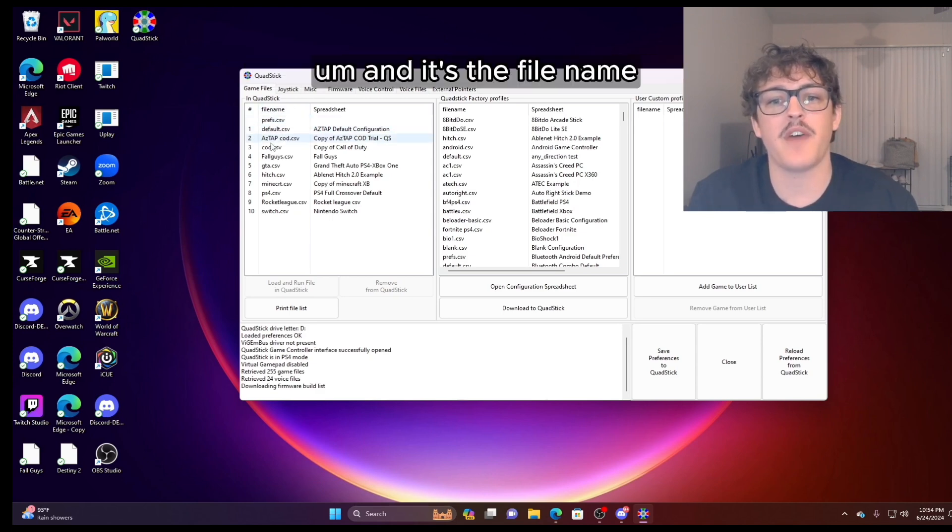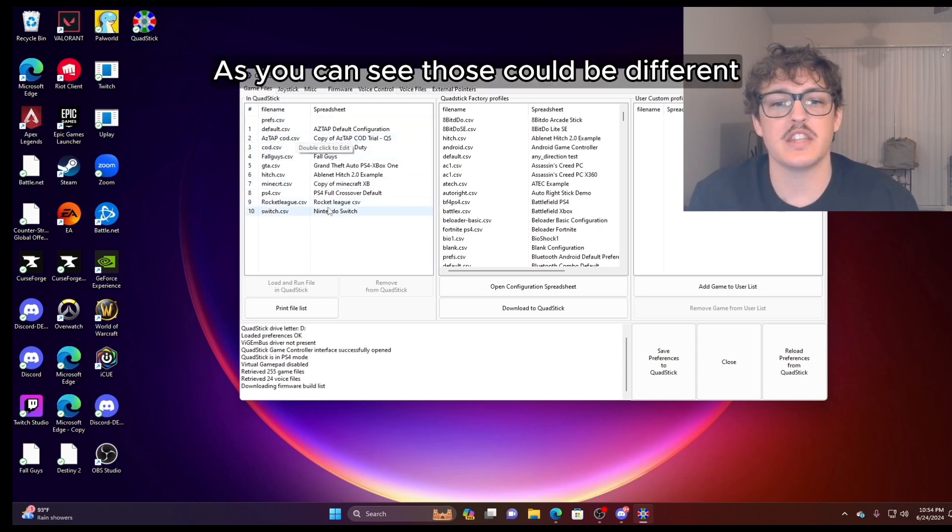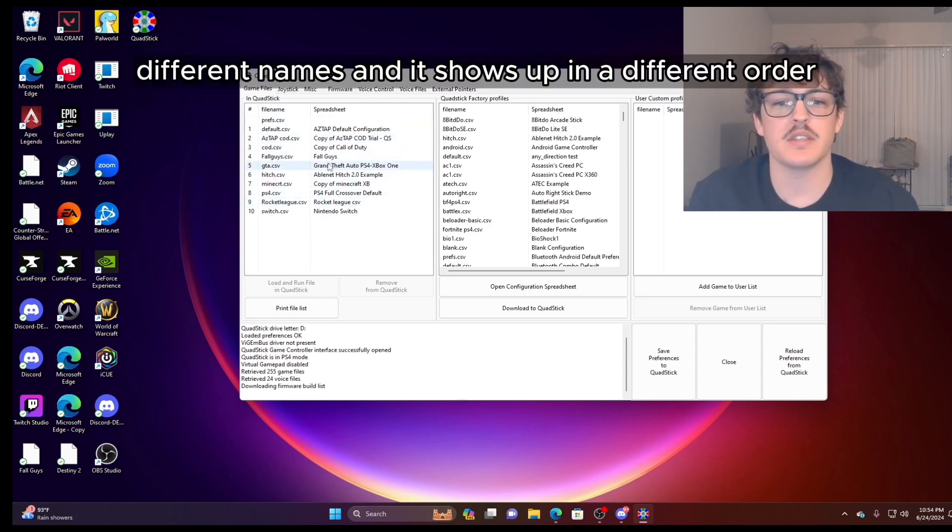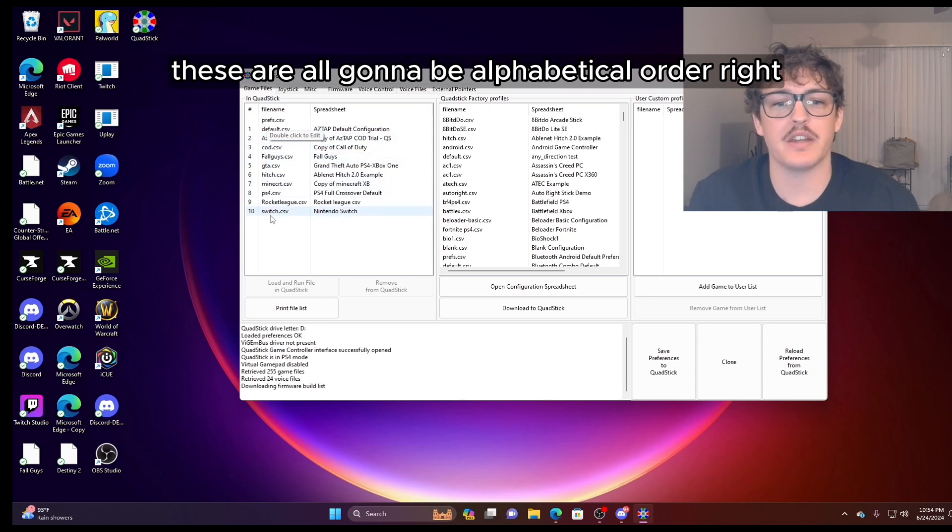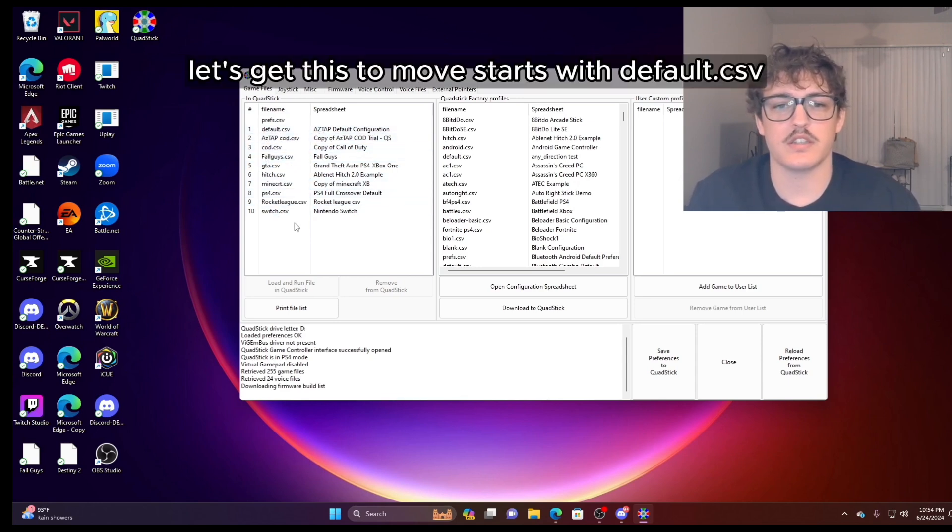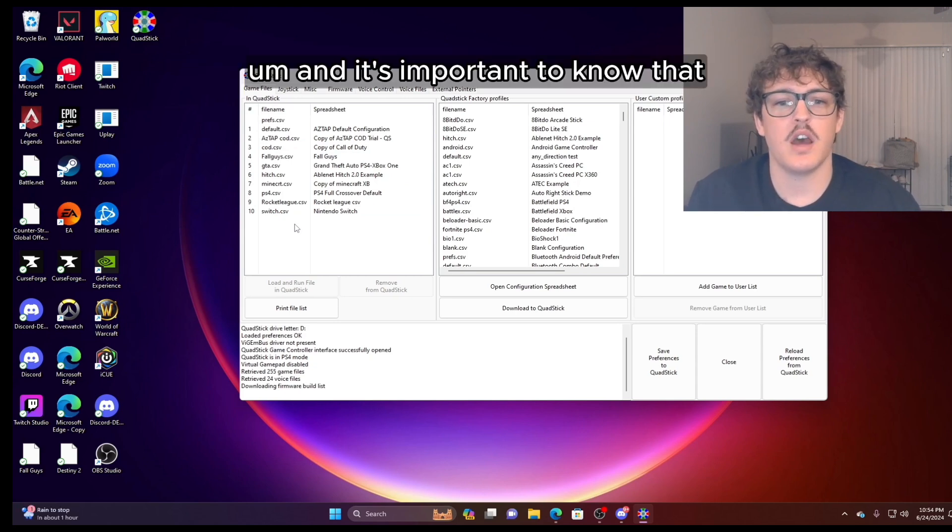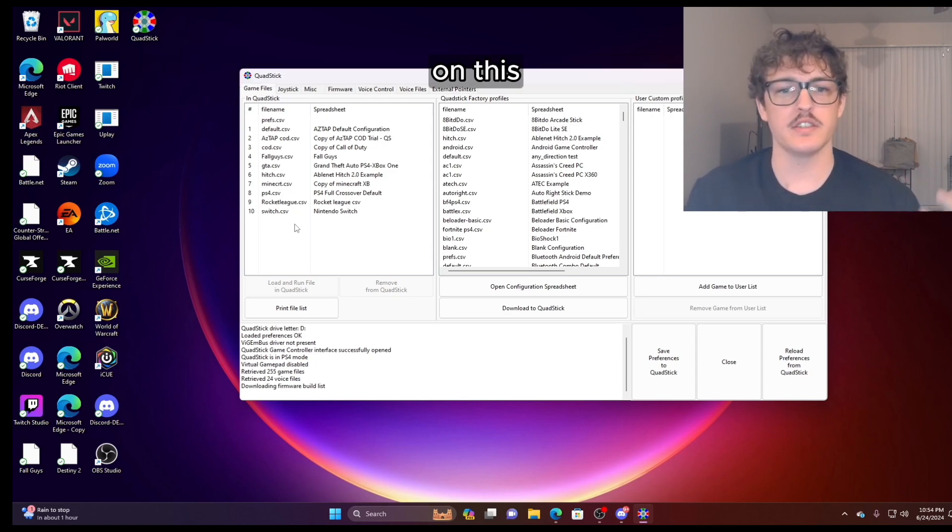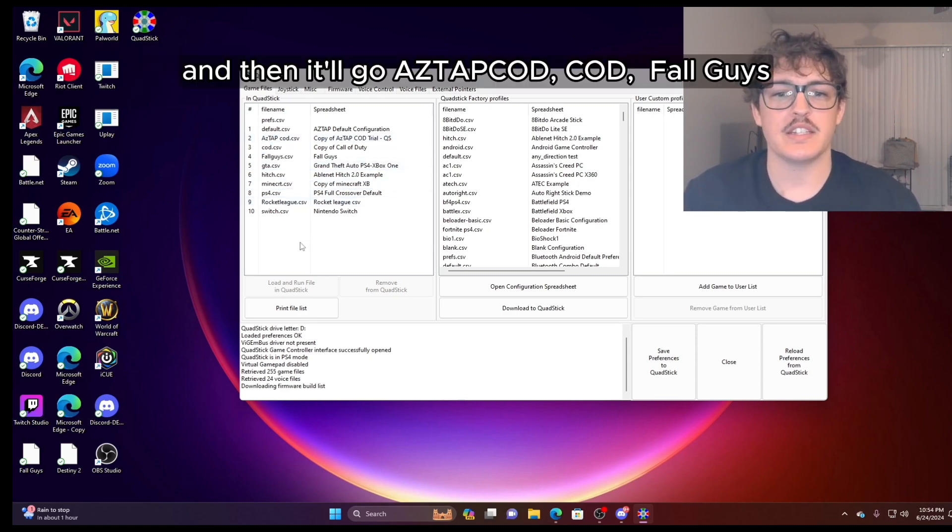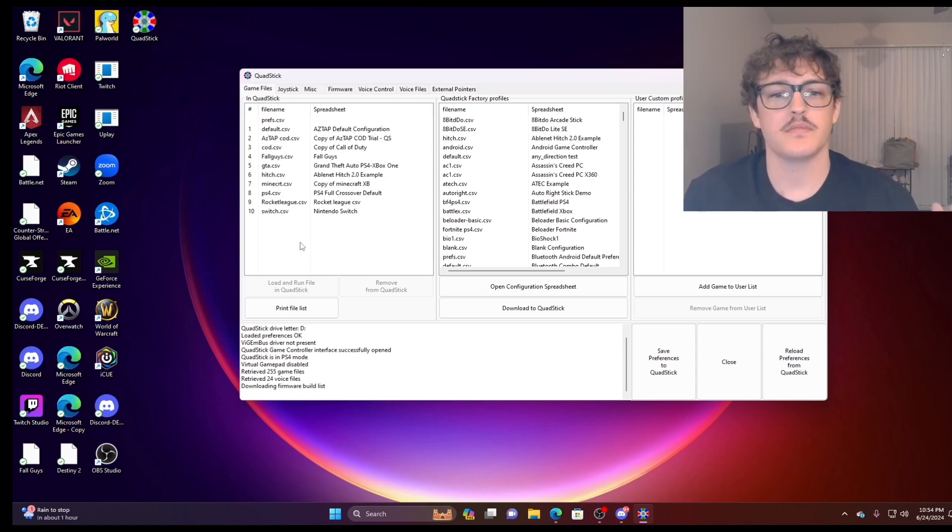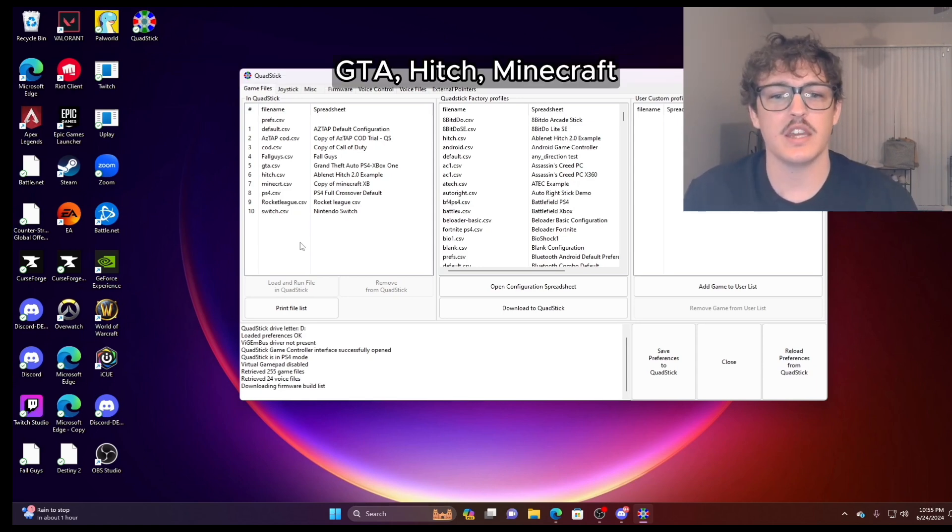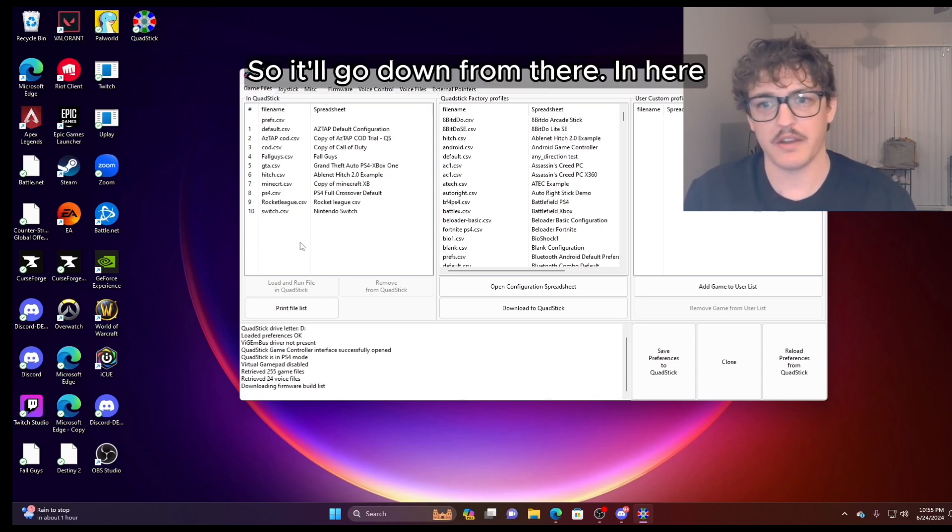These will all appear in this column in alphabetical order. And it's the file name, so not the spreadsheet. As you can see, those could be different names and it shows up in a different order. But these profiles, the file name here, these are all going to be alphabetical order. So it starts with default. And it's important to note that the default is always going to be the number one profile on this. And then it'll go AZTAP, COD, COD, Fall Guys, GTA, Hitch, Minecraft, and you get the gist, so it'll go down from there.